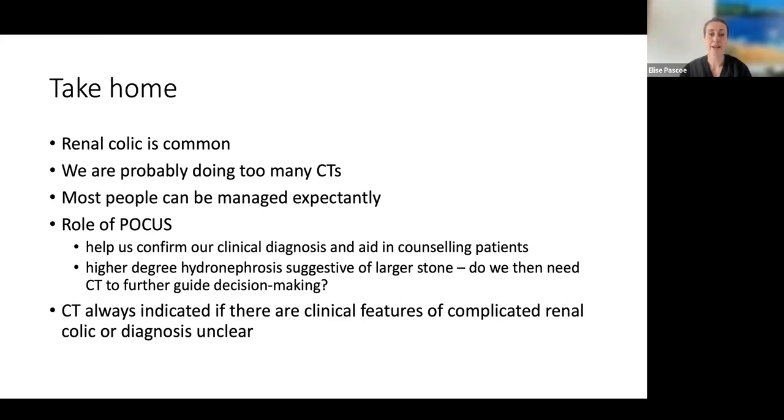If a higher degree of hydronephrosis is suggestive of a larger stone, though, which we don't really have fantastic evidence that that's the case, do we then need to do a CT to guide our further decision making? That's a question that I think we need to ask ourselves. And I think if we all saw a really quite severe hydronephrosis with cortical thinning, most of us would be thinking about then doing a CT to interrogate that further.